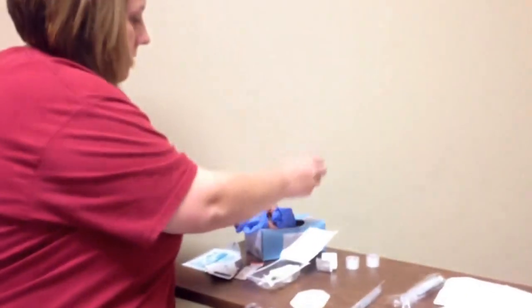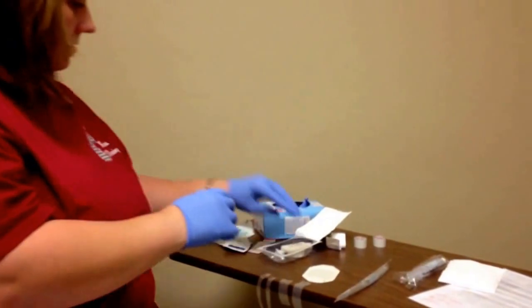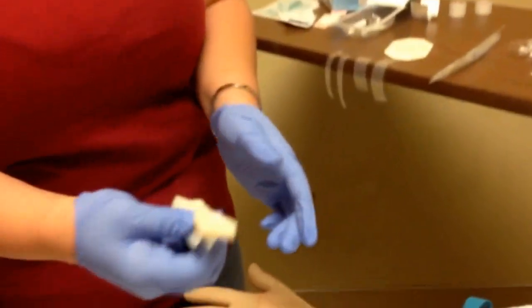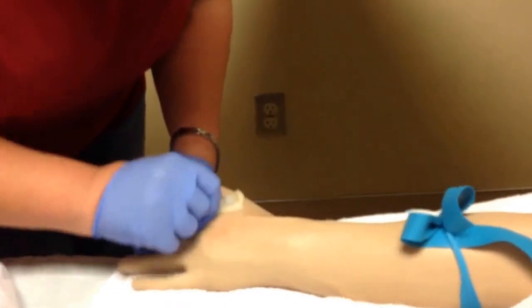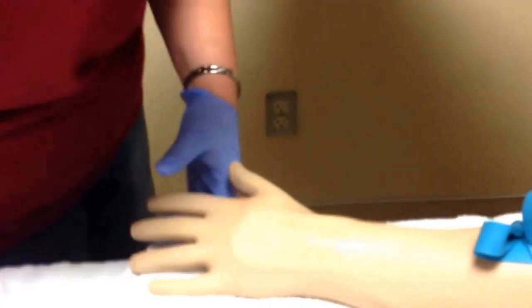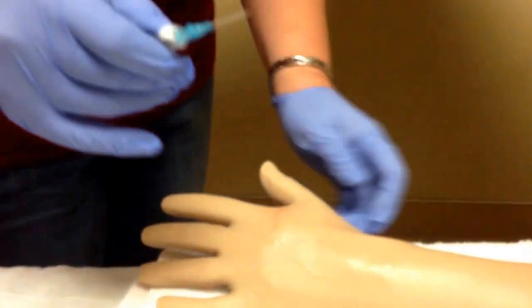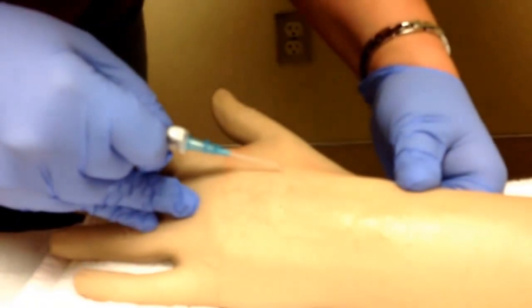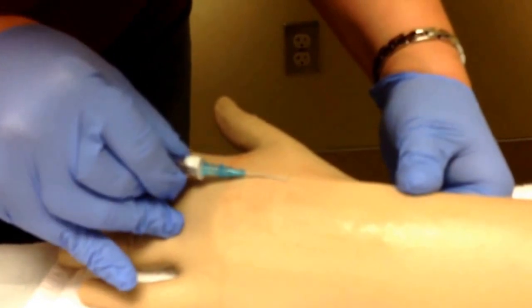All right, Mr. Dunn, I'm going to reapply the tourniquet and put my gloves on. I'm going to activate my chloraprep — just squeeze it and it will pop. With chloraprep, we go back and forth or side to side; we do not go in a circular motion. That's going to dry. I'll get my IV catheter with the bevel up. I'm going to hold a little bit of pressure on my vein and go in at an angle. Once I get into the vein, I'll get more flush with the skin so I don't go through it.